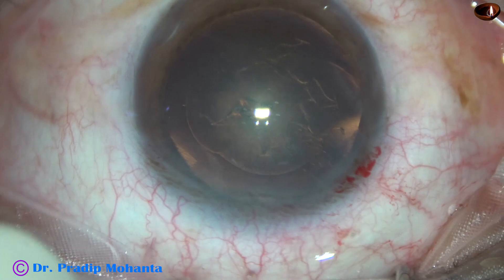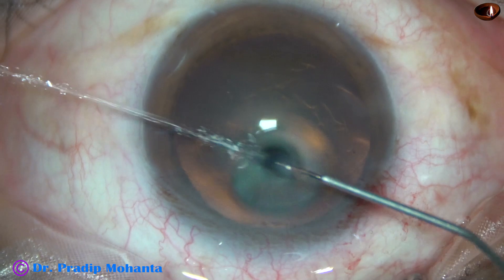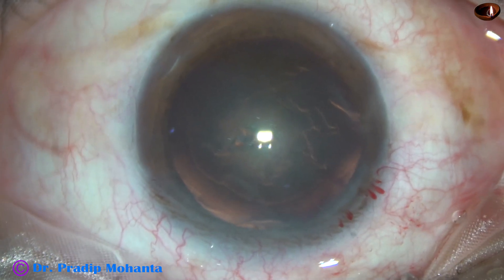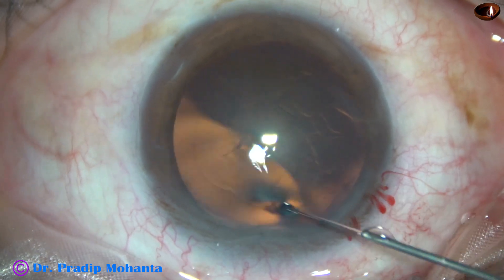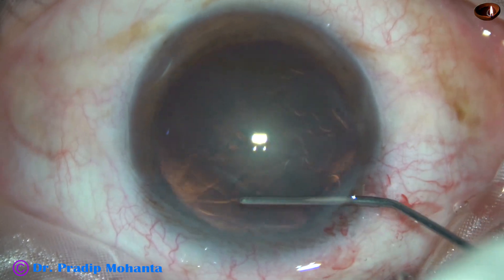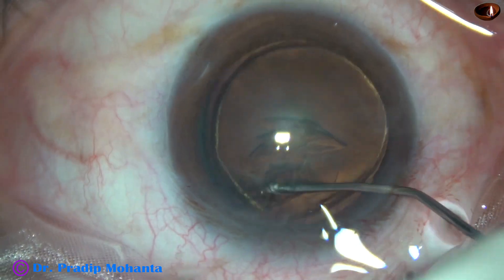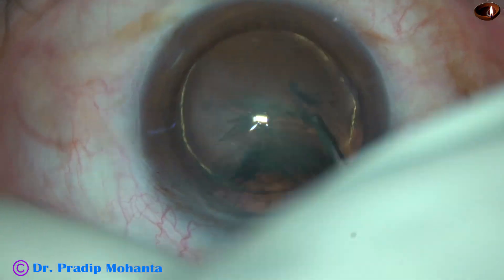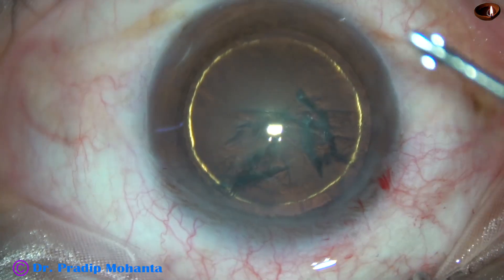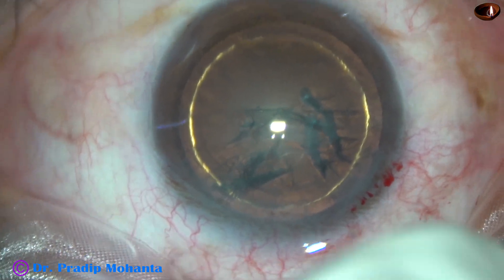Now, hydro-dissection and hydro-delineation. This is a 27-gauge cannula. Visco is expressed out. Hydro-delineation has produced a beautiful golden ring in this case. The anterior chamber is again filled up with visco.